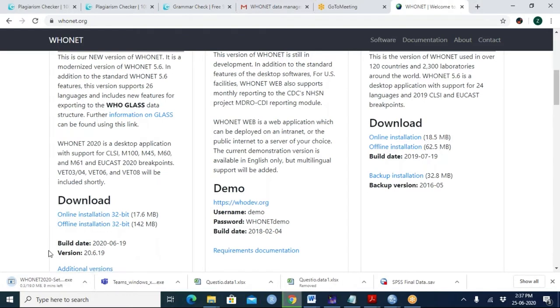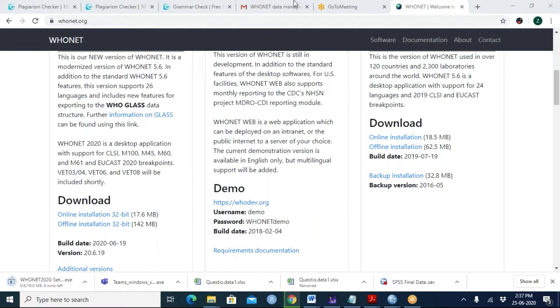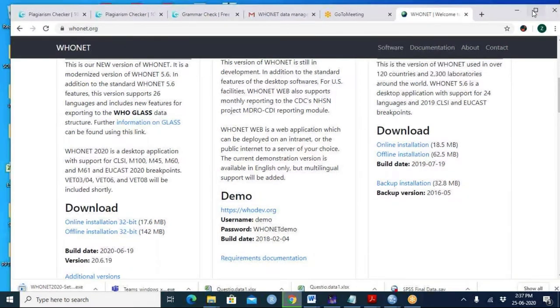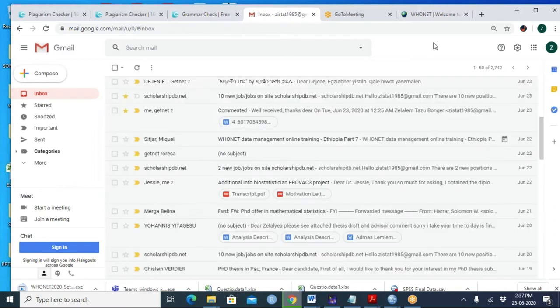Now that we're doing that, I'm going to just send you an email right now. I'm going to put in some macro files. Go to C drive, WHONET, macros. I'm going to zip those, send to zip. I think that should do it. Good. So I'll now email that file to you.